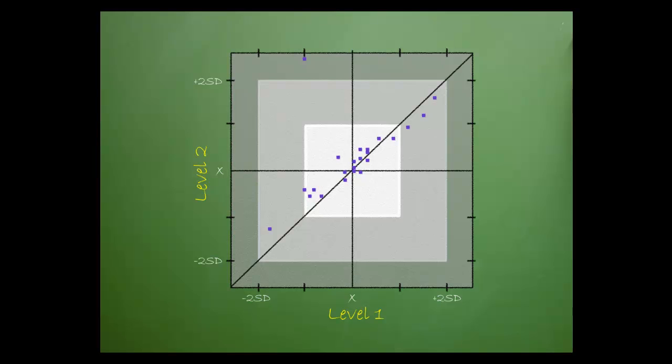Points that are near the angled line and within 1 or 2 standard deviation squares show acceptable results. Points that lie near the angled line but are outside the 2 standard deviation square indicate systematic error. Points that lie far from the angled line indicate random error.